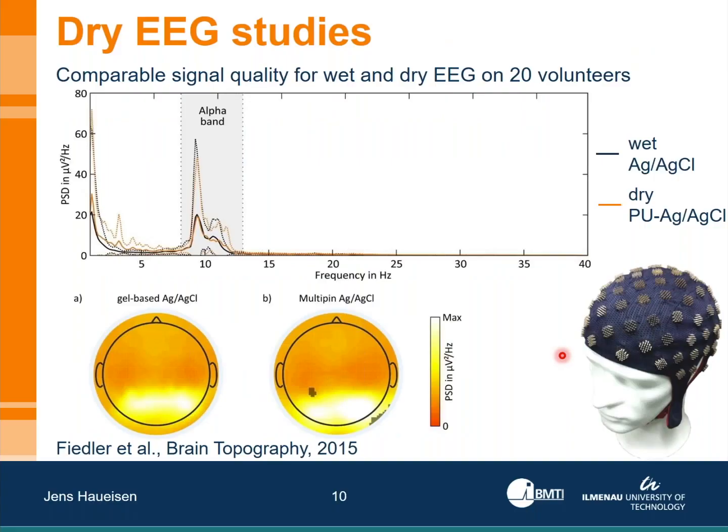And this is what you see here as a main result for this eyes open, eyes closed paradigm. Namely, you see the alpha band activity in a relaxed state for the subjects, and you see two lines, an orange one for the dry and a blue one for the wet. And you see the power spectral density and the increase in the alpha band as a grand average across all subjects.